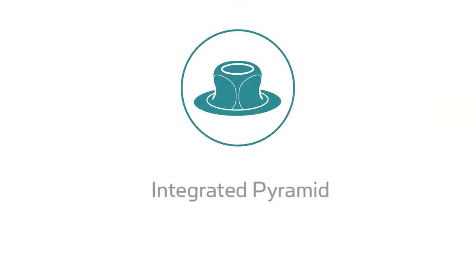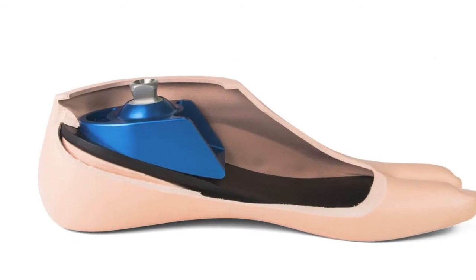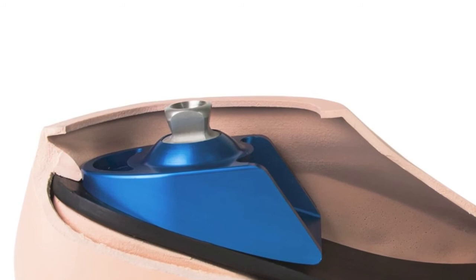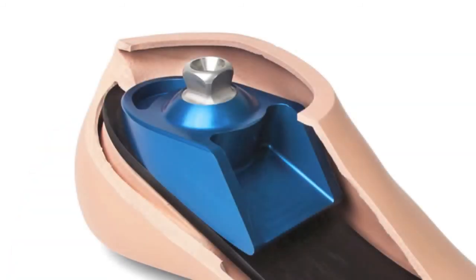The Breeze comes complete with an integrated pyramid for strength and weight savings and gives the foot a lower profile. Our integrated pyramid aids in cost savings as it eliminates the need to purchase a separate component.